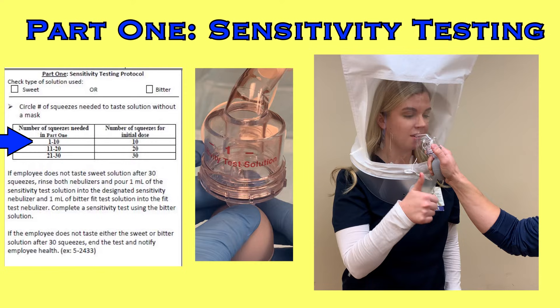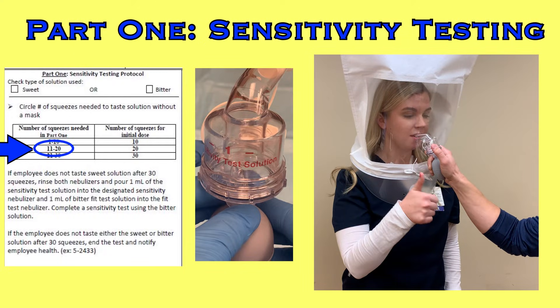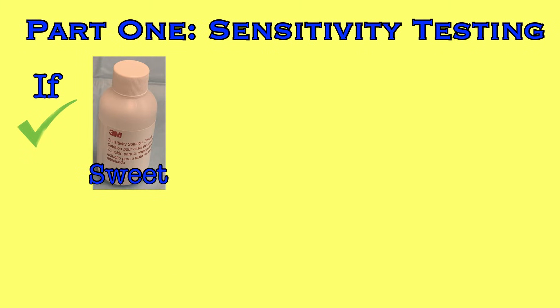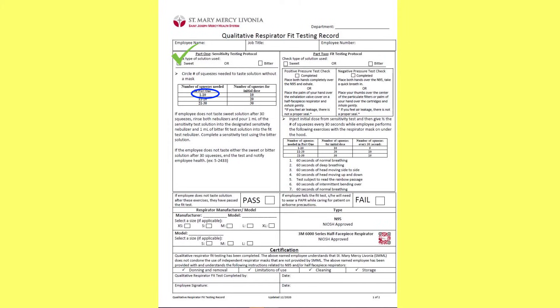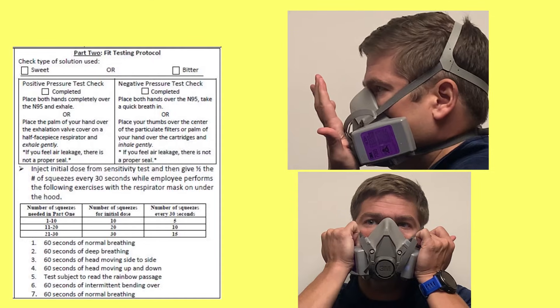If they taste the solution in the first 10 squeezes, circle that on the form and move on to step two. If they did not taste it in 10 squeezes, squeeze 10 more, circle that line if they tasted it, and if not, squeeze a final 10 sprays. If they didn't taste the solution after the full 30 sprays, the sweet solution won't work for this person and you will need to change to the bitter solution. Indicate which solution they were able to taste and how many squeezes it took. Remove the hood, allow the taste to dissipate or give the colleague some water, then have them don the respirator and perform a positive and negative pressure check. If successful with both, indicate complete on the form.